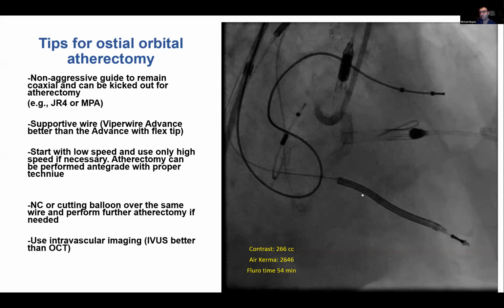Right now with the Papyrus is more deliverable, and with the extensions that can be used to at least be delivered to the perforation site and seal the perforation until we deliver the Papyrus. How often do you still use a ping pong technique to deliver covered stents? Do you think it still should be the standard for using, just challenging the standards?